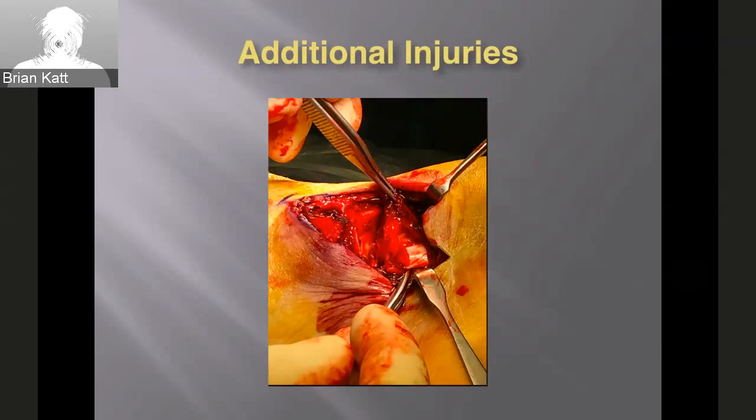Additional injuries. This is just a picture of that first ankle fracture dislocation that I showed you guys. I actually couldn't get it reduced. It was really embarrassing. Katie was there. She can account for that.